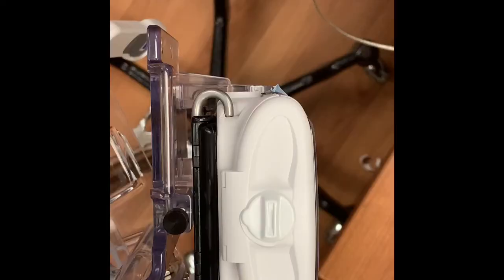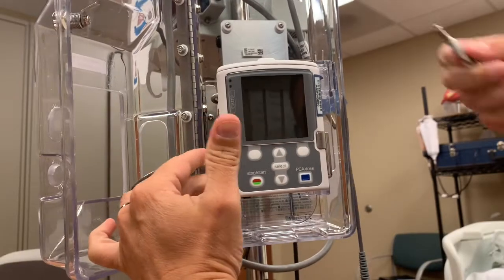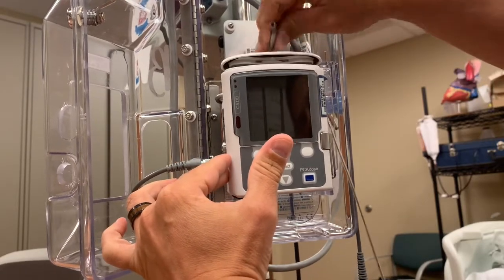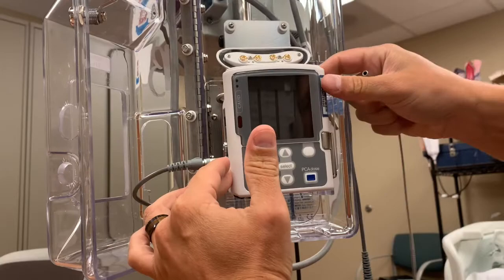On the top of the pump, you'll notice a small knob that's able to be turned. You can turn it by hand if that's possible. If it's too tight, use the side of the key in the groove to turn the knob. This will give you access to the battery compartment.